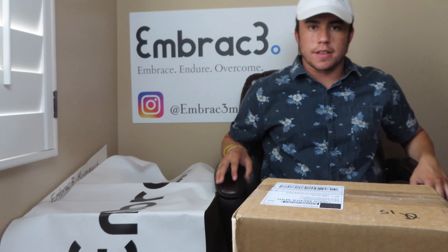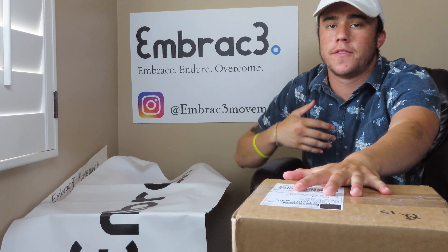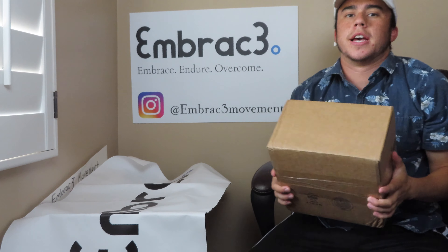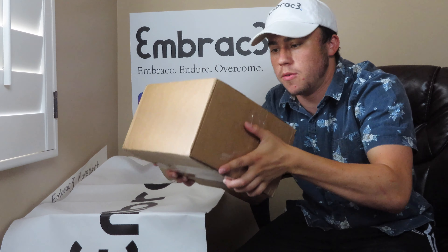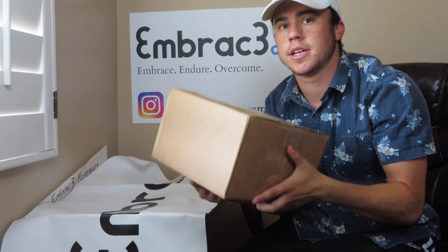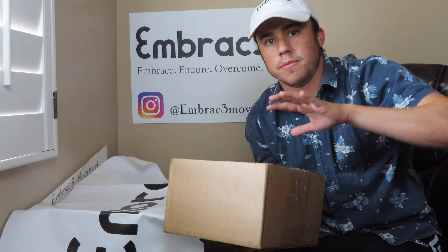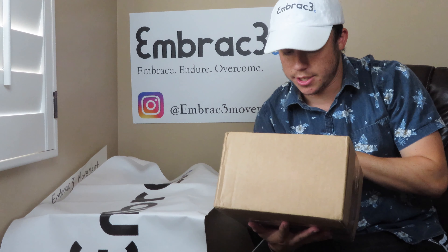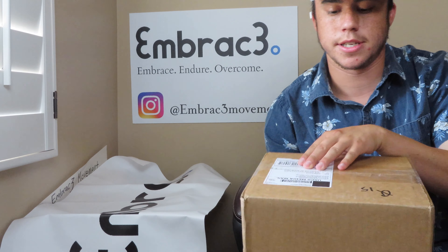Hello and welcome to another unboxing video. This box, as many have been, was delivered by one of our followers to be helped to get in the right hands of another diabetic who cannot obtain or afford these necessary supplies. What Embrace does is we accept donations and then get them in the right hands. This one was sent to us — it says Cryo Warehouse on here.